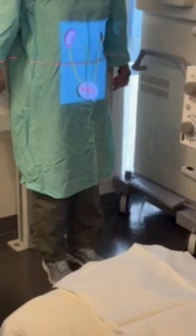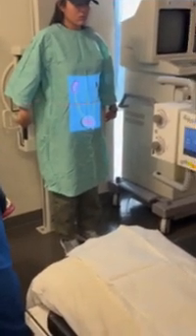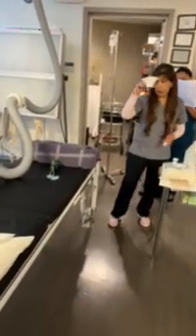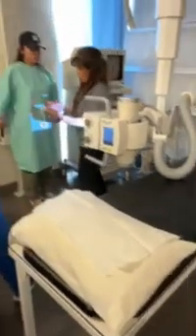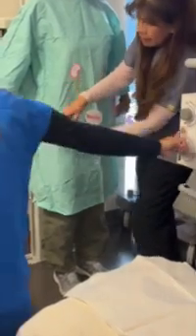Now, not voiding, post void. Now, one important thing, when the person went to the restroom, you guys gave one of these. What's the purpose of this one? To catch the kidney stones. Kidney stone, if the patient that we are doing, you wanna hit the light for me, please? Thank you.